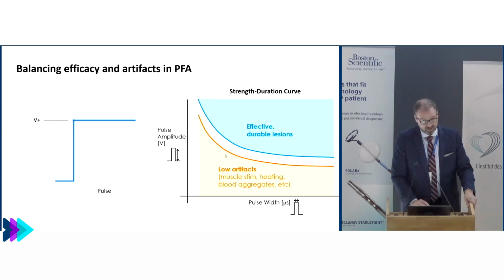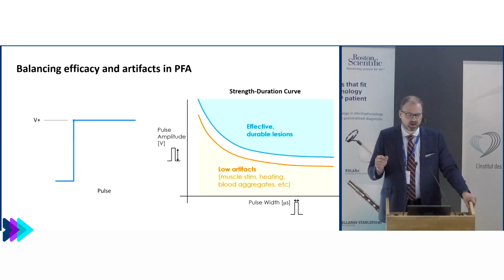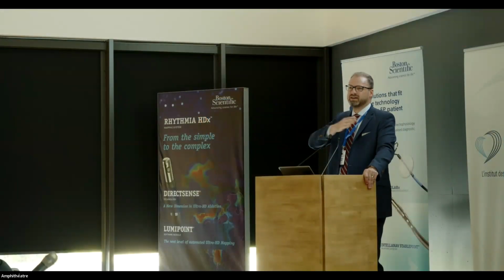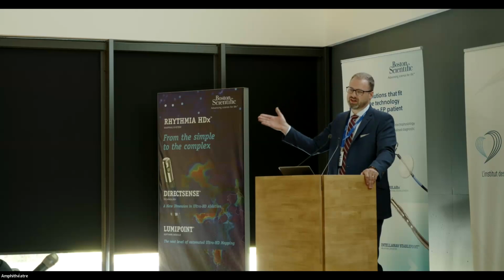And I will say, you can electroporate. Electroporation is actually deceptively not hard to do. You can electroporate, as you may know from the history of cardiac PFA development, with the defibrillator. You can electroporate with a defibrillator, and you can be effective. And you're talking about millisecond long pulse widths. So there's a lot of different waveforms that we and the talented people that I work with at Boston Scientific have used to create effective durable lesions. They just had a lot of other problems. And so the trick is not in actually getting to an effective durable lesion, it's avoiding all the other stuff.